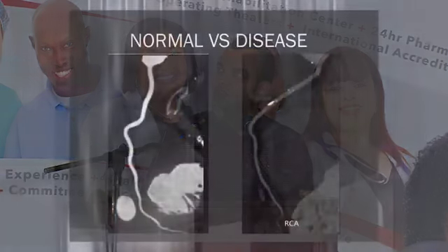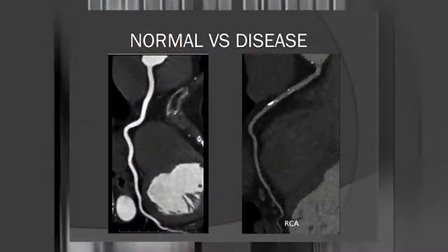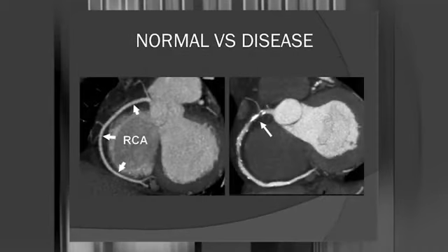Another vessel to show you a disease, normal vessel and diseased vessel. You see a plaque here by the side, small calcific specks. If you can eyeball or guesstimate here, it's about 50% stenosis. Coming more to significant disease. This is a normal artery here, and if you go to see the disease on this artery, very significant. Large plaques, small plaques, but all along the length of the vessel, there is significant atherosclerosis.